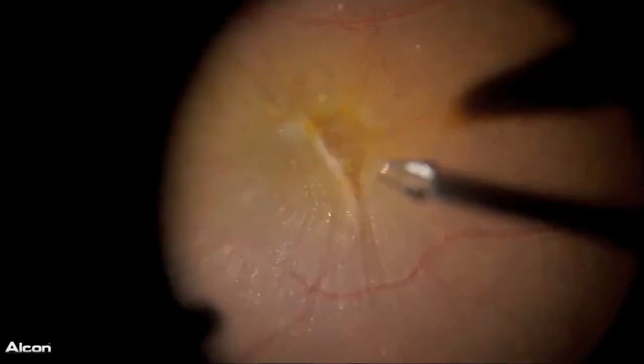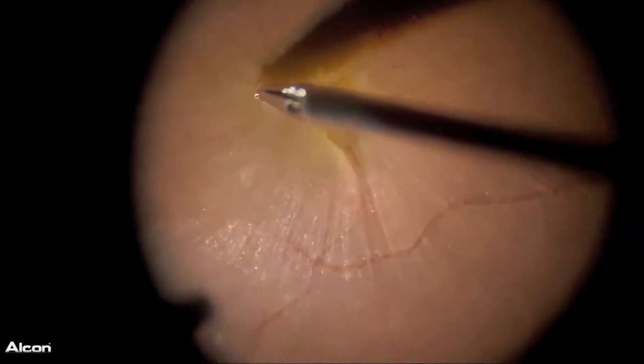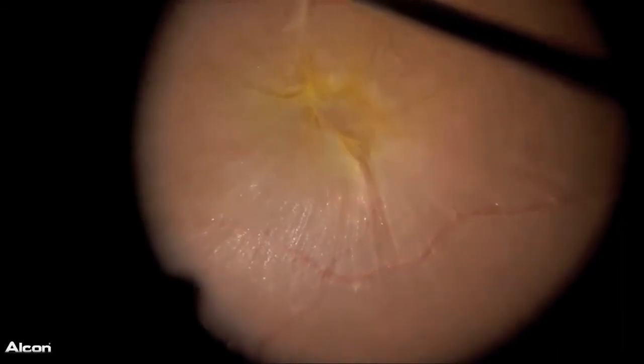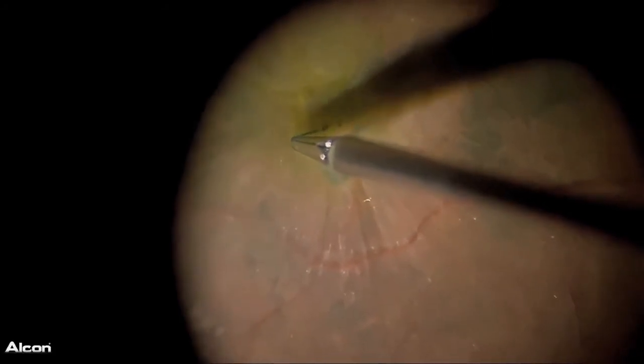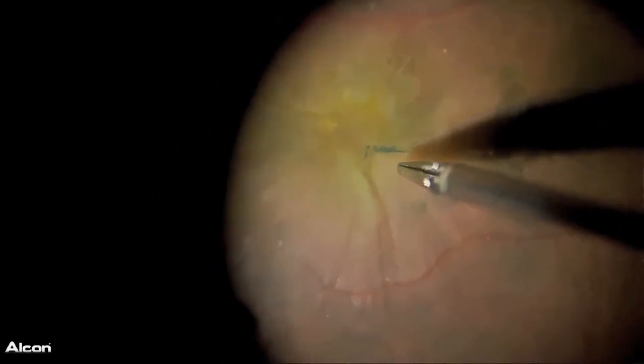This is a surgical video of my procedure treating a patient suffering from epiretinal membrane. The contact lens and 3D system allow us to have a better resolution than the conventional operating microscope.